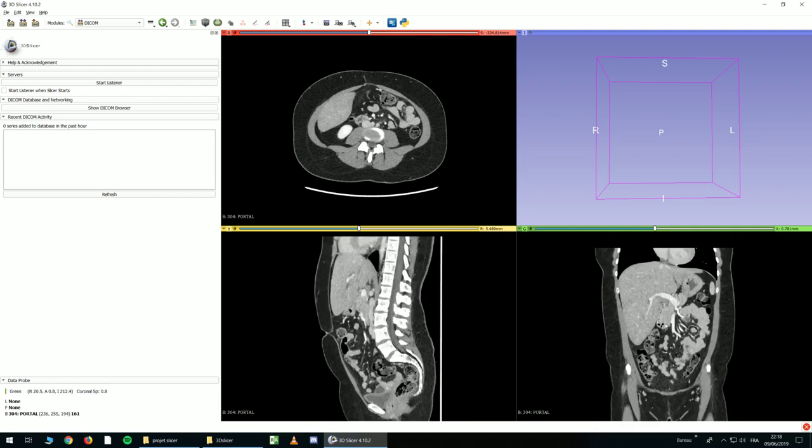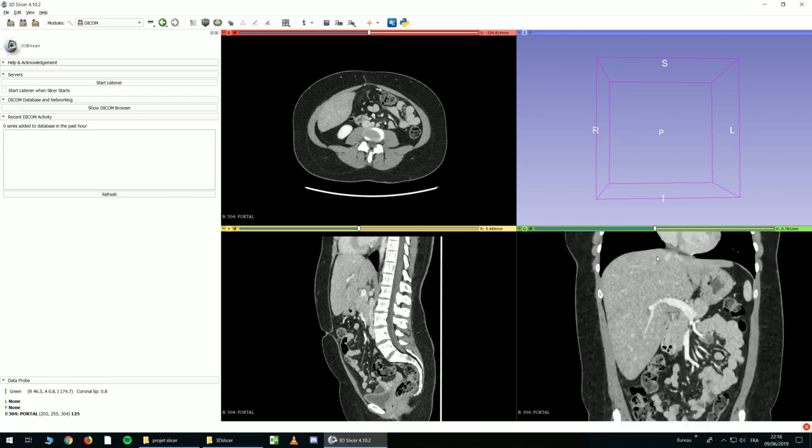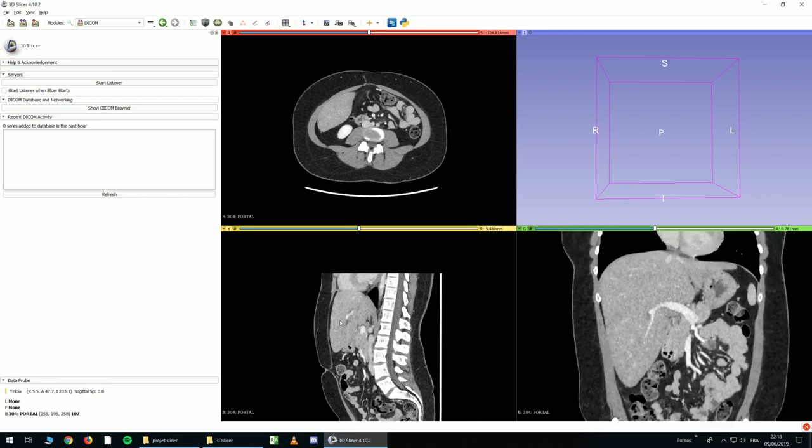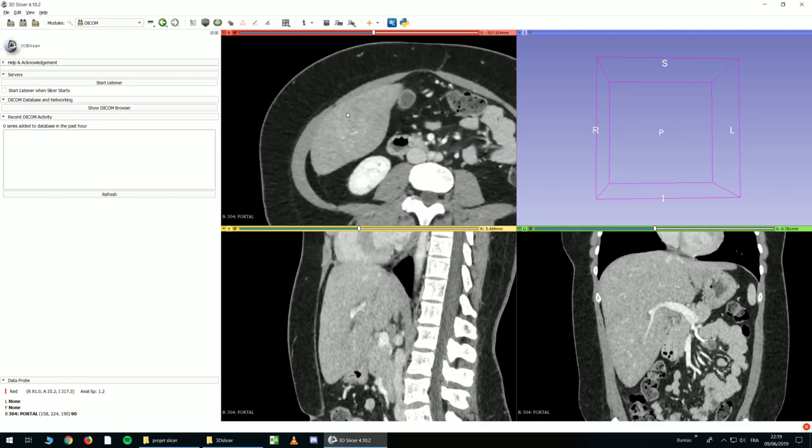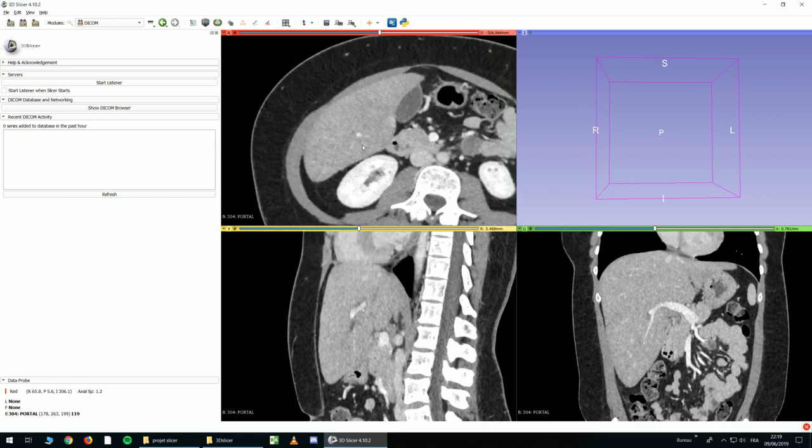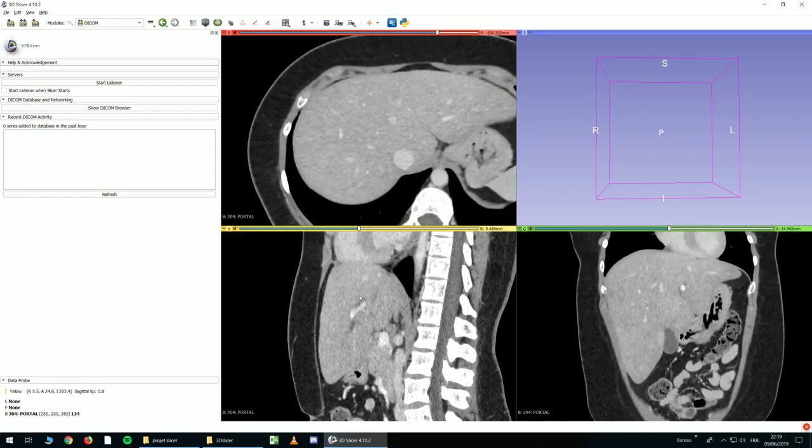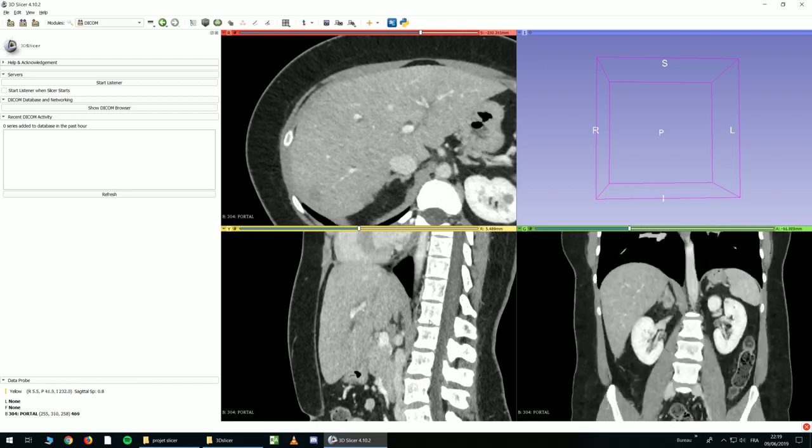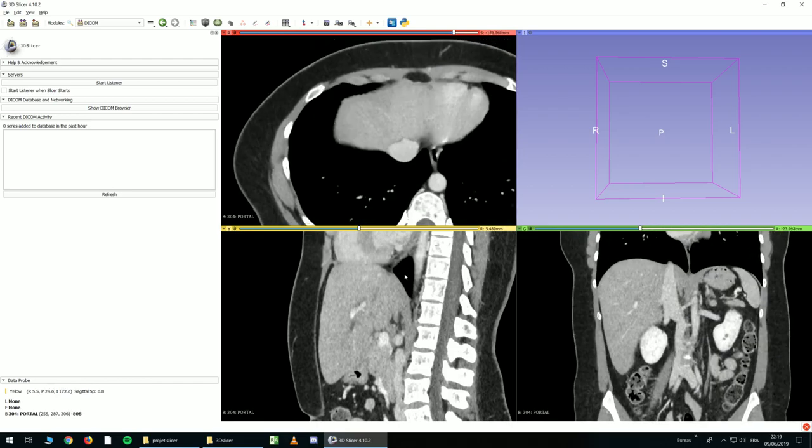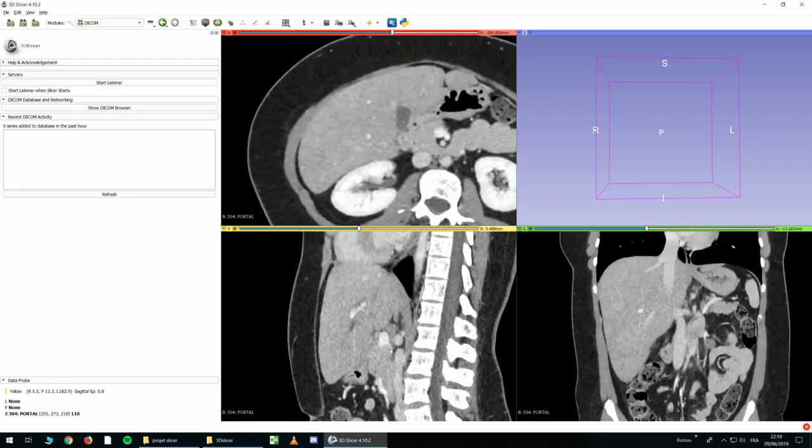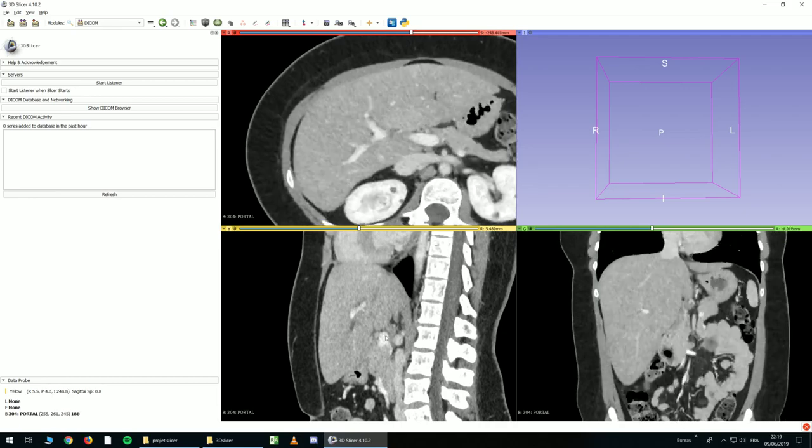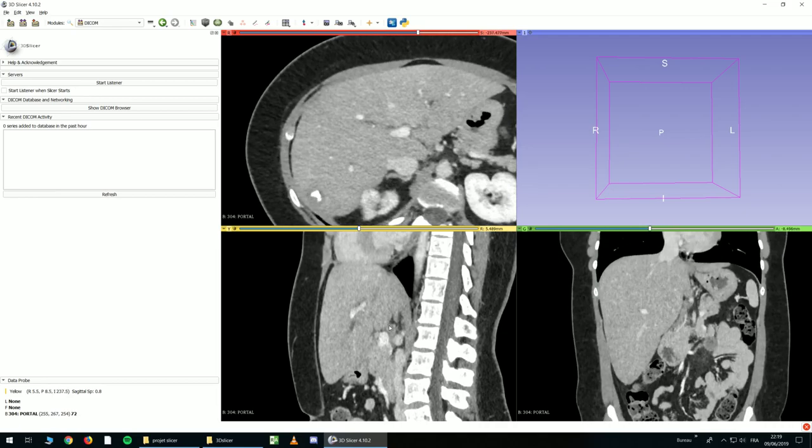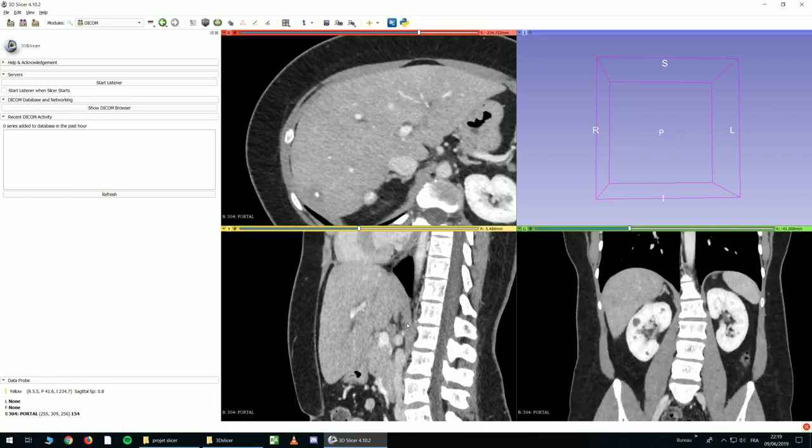So, for example, we want to see only the liver, and we can do this. And if you hold Shift and move the mouse, it will automatically adjust the view on the other slices. In coronal, sagittal, and axial view. So you hold Shift and you move the mouse.